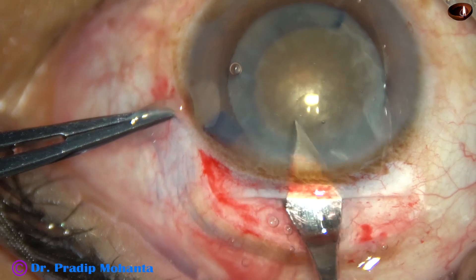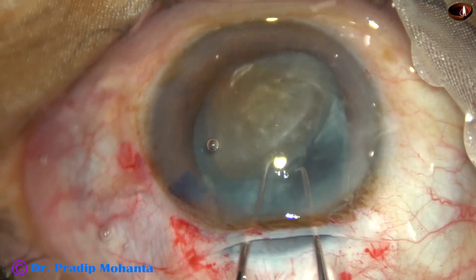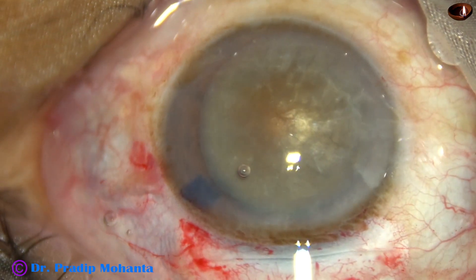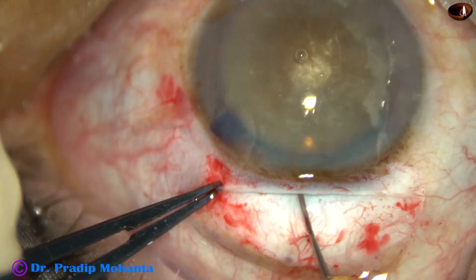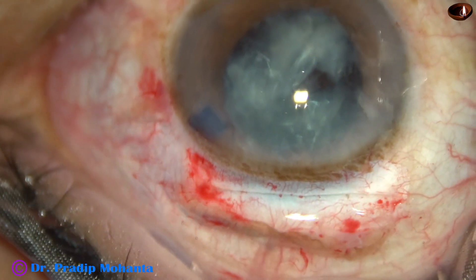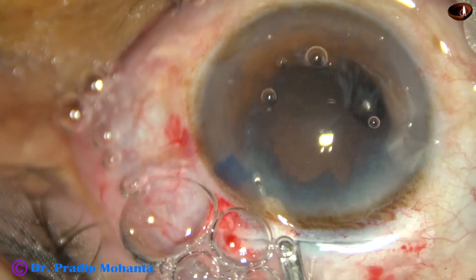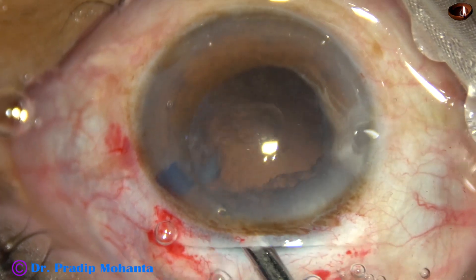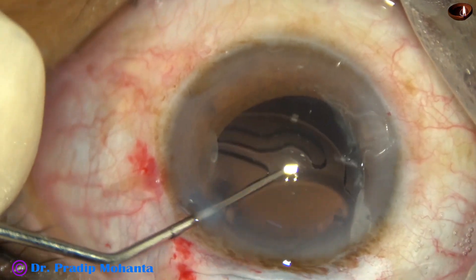The tunnel is made; the incision size is about 7 mm. The nucleus is prolapsed. Again, I prefer the visco-hook to deliver the nucleus — it goes in and the nucleus is easily delivered out of the eye. The cortex is cleared, and a lens is placed in the bag.